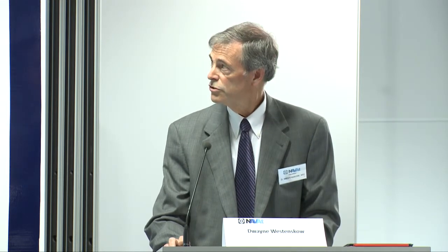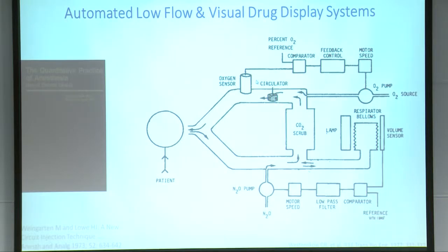Of course, it's also critical to keep the oxygen concentration constant in the circuit. So the desired inspired concentration is entered in, and a feedback controller then controls the delivery of oxygen to keep that circuit filled with the desired oxygen concentration.